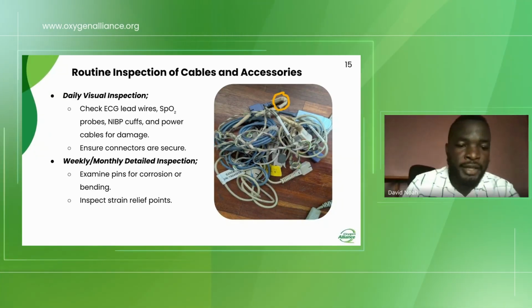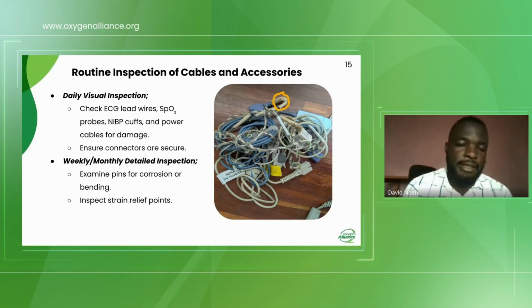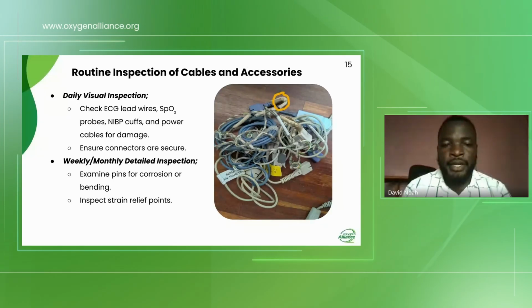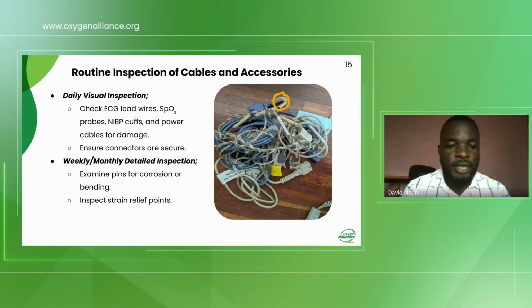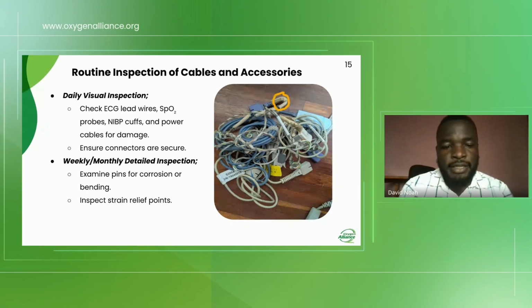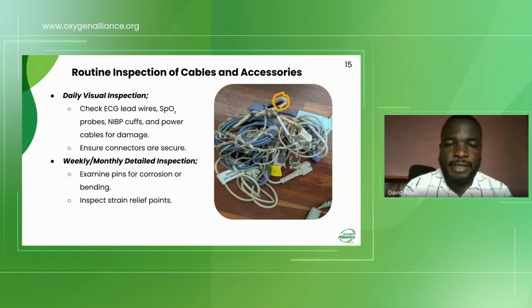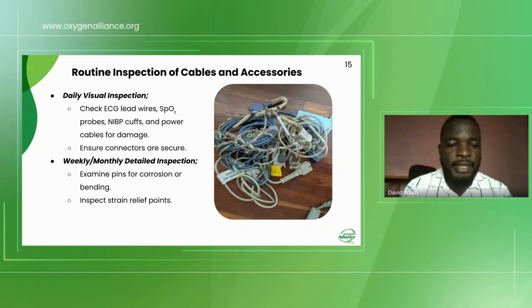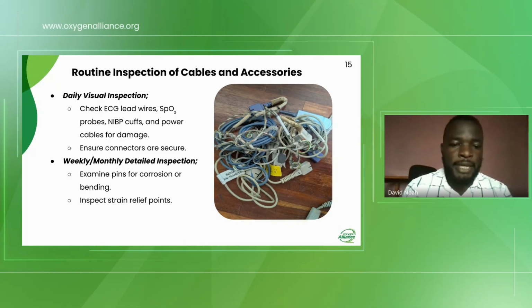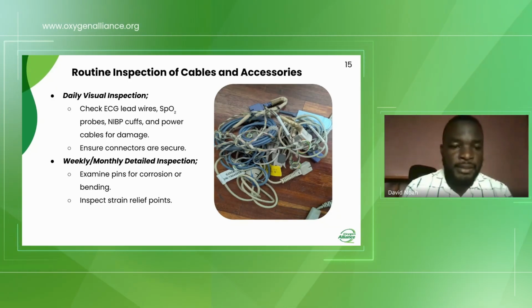So in the long run, you also have to make sure that clinicians and the users of these cables are trained on how to properly handle these cables. Because in the end, these damaged cables might affect the signal with artifacts, or in some cases cause complete signal loss, which might in turn affect clinical decision making.